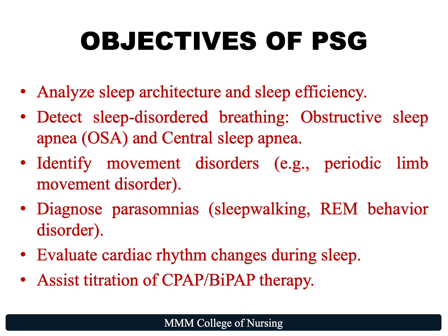And central sleep apnea. This is a disorder where the brain fails to signal the breathing muscles, causing pauses in breathing during sleep, unlike obstructive sleep apnea where the airway itself is blocked. PSG can also be used to identify movement disorders.